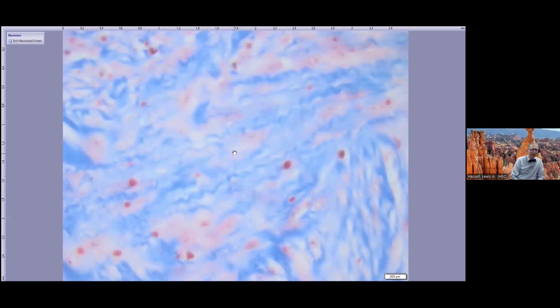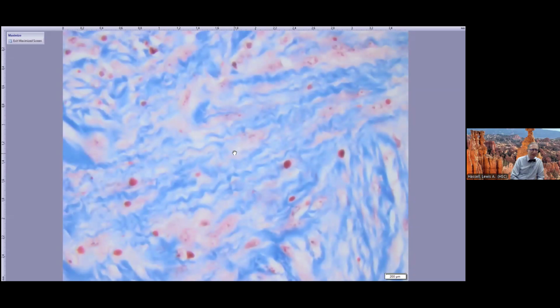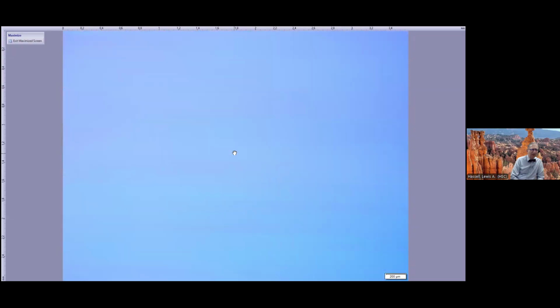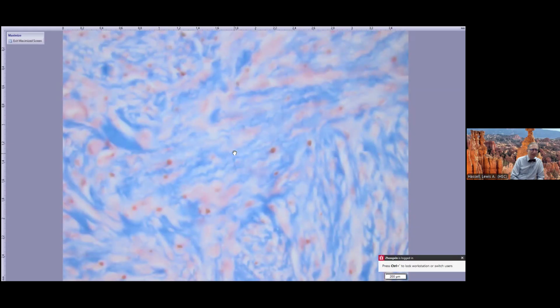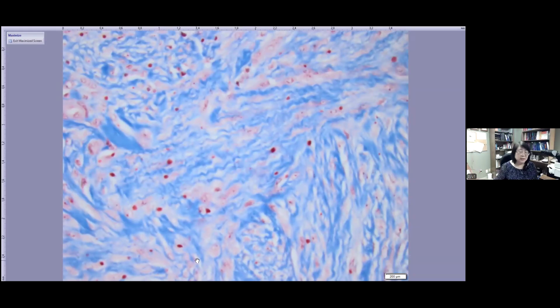Yeah. Clear enough, right? Those inclusions.